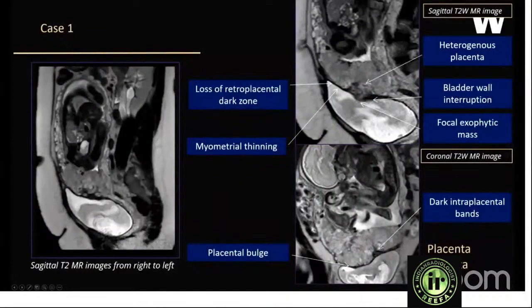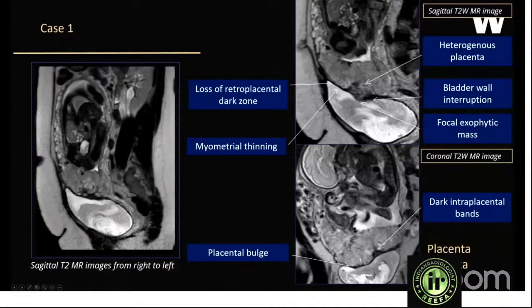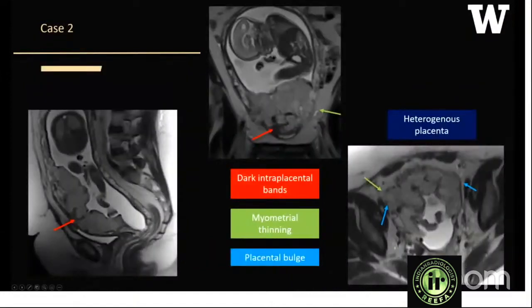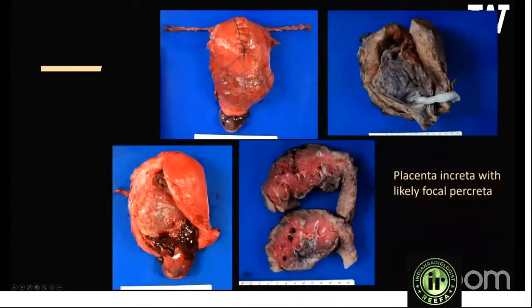Case 1: Sagittal T2-weighted images showing a focal placental bulge, myometrial thinning, loss of retroplacental dark zone, heterogeneous placenta, bladder wall interruption, focal exophytic mass, and dark intraplacental bands. This was a patient with placenta increta. Case 2: Red arrows show dark intraplacental bands; green arrows show myometrial thinning — the myometrium is well-visualized superiorly but completely thinned out inferiorly. Focal placental bulge is seen bilaterally with intact serosa. This patient underwent hysterectomy and had placenta increta with likely focal percreta.